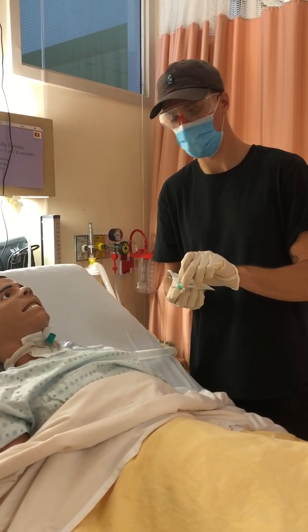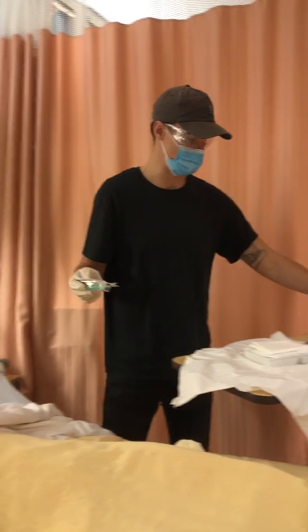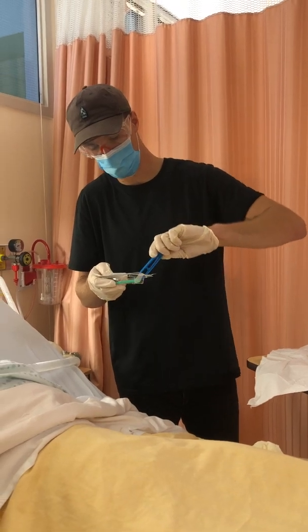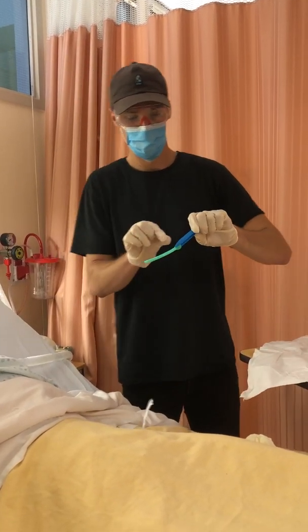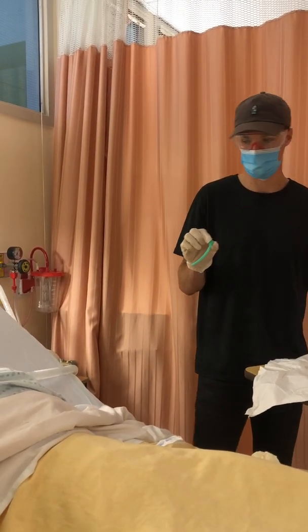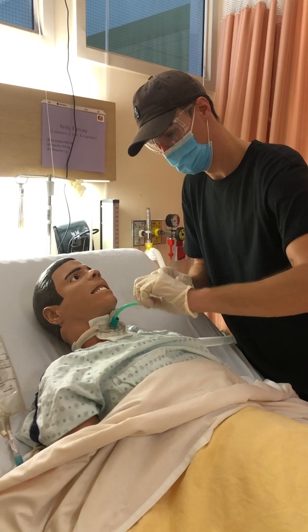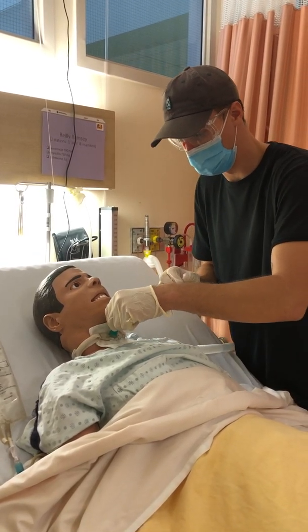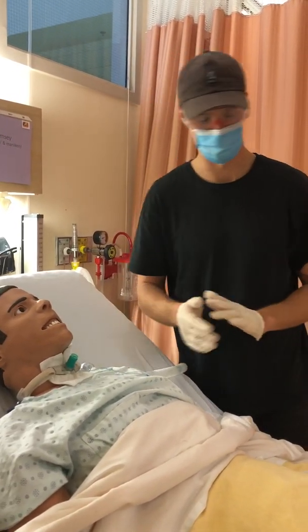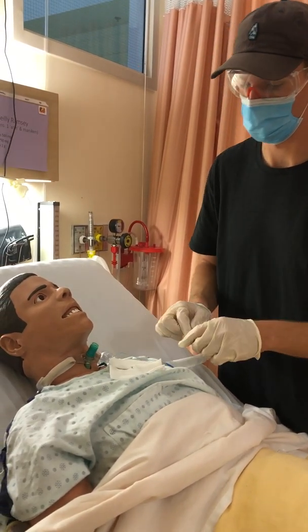open this, and this has to remain sterile, but I can touch the outer part of the inner cannula. So I'm actually going to use my sterile forceps to grab it out of the container, and then grab the outside of this, and then these would be garbage since I touched them. This needs some practice, but put it in at an angle, make sure it's in there. I would stabilize before doing that instead of just making it move around like that. That was pretty bad.